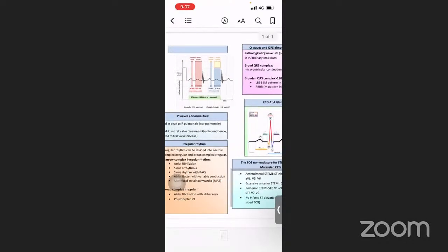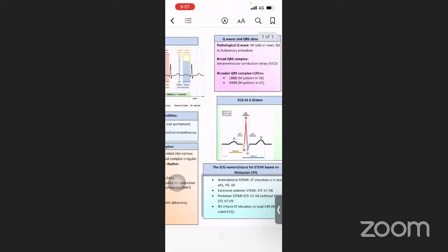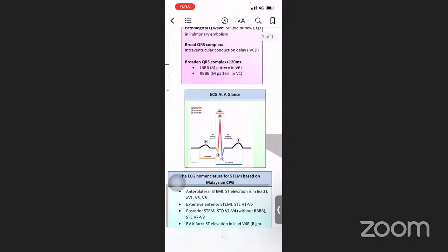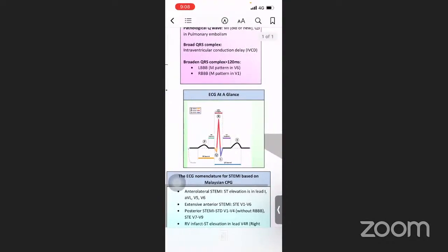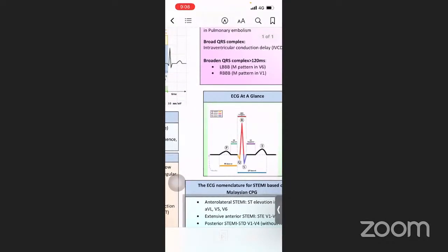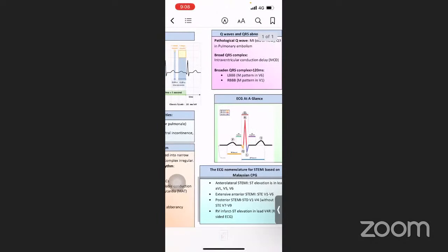One is based on each waveform: P wave abnormalities, prolonged PR interval, prolonged QRS, ST segment either depression or elevation, and the T wave either very tall and tented or with the presence of a U wave. So this one is based on the morphology of the PQRST.